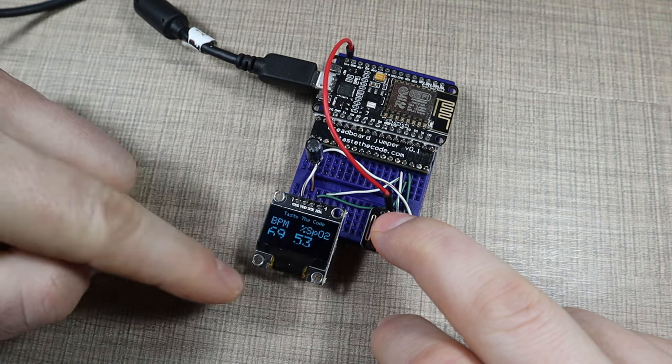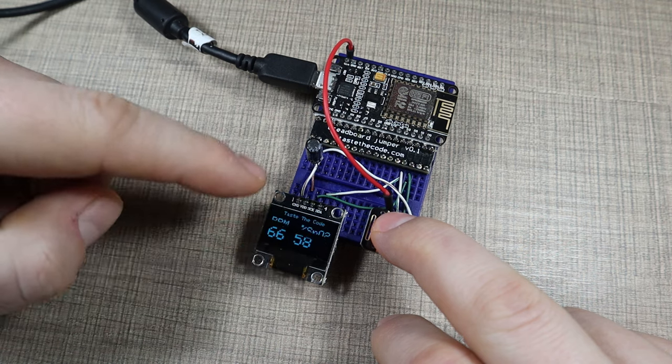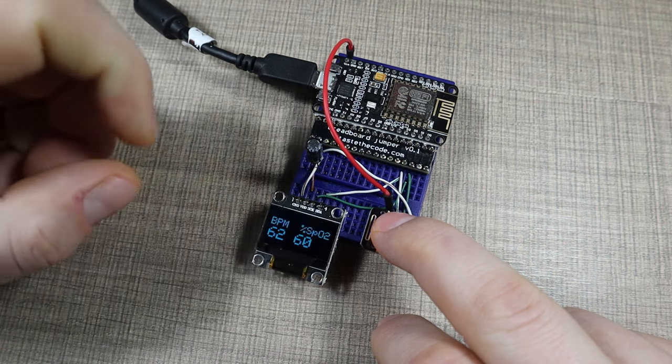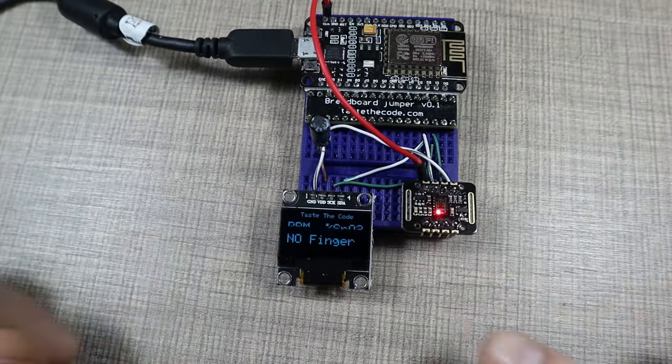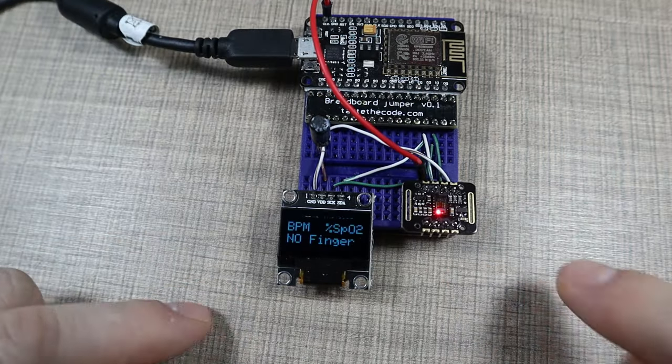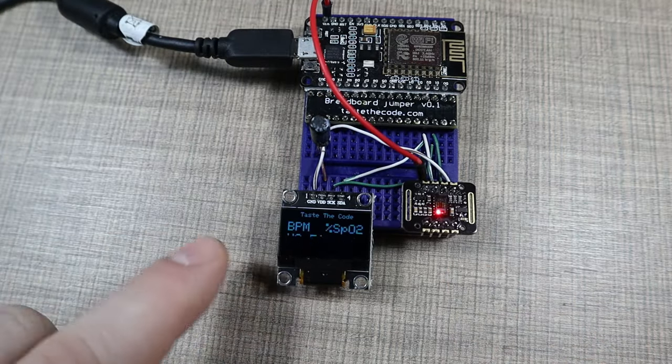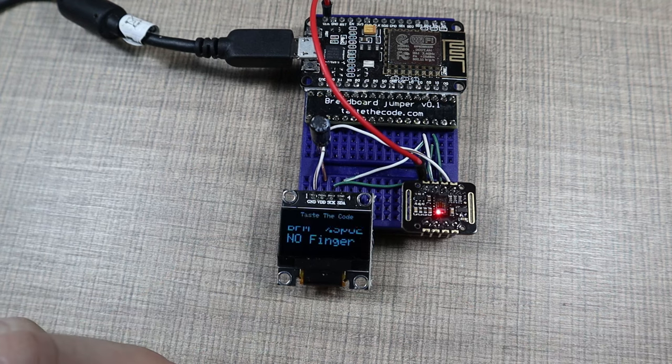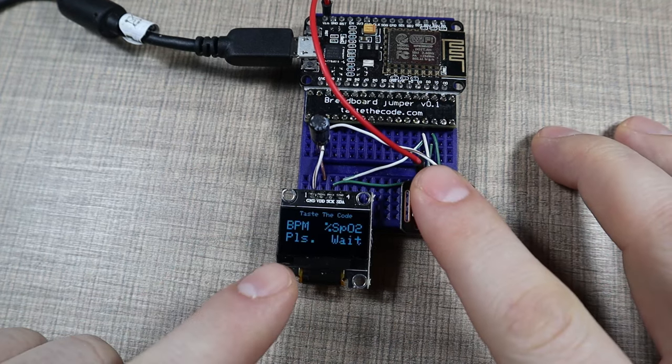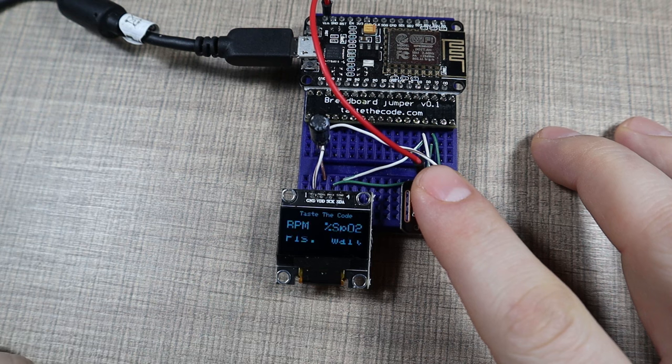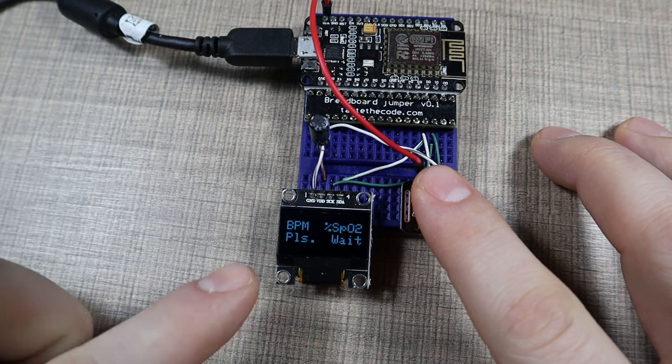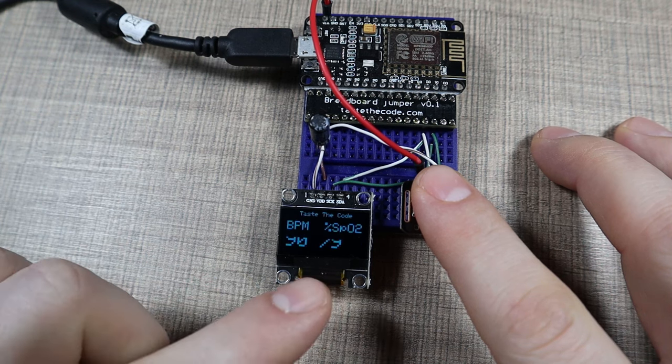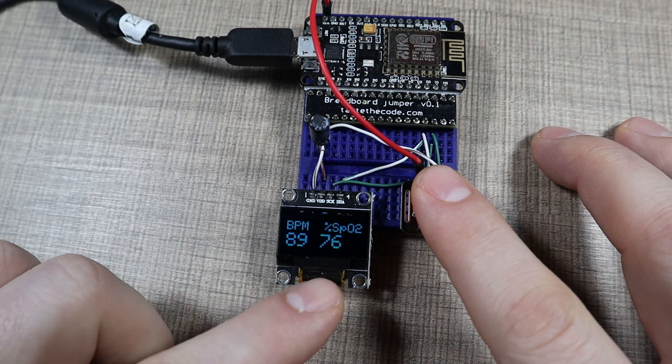The sensor can also detect the presence of the finger, so you can see on the OLED as soon as I place my finger, the text changes to 'please wait.' That indicates that we've started measuring, and then once it acquires a value it starts displaying the measured values onto the screen.